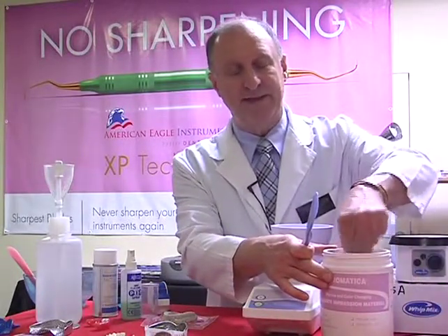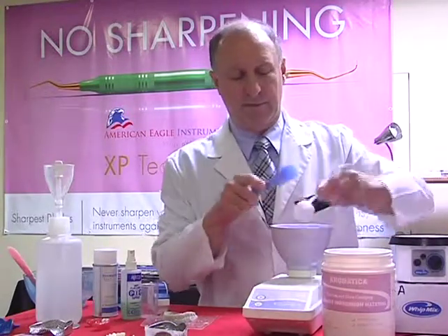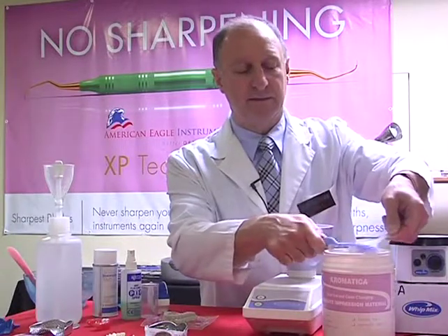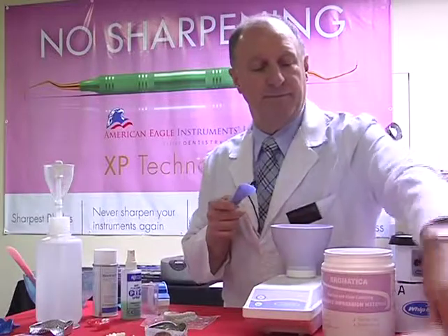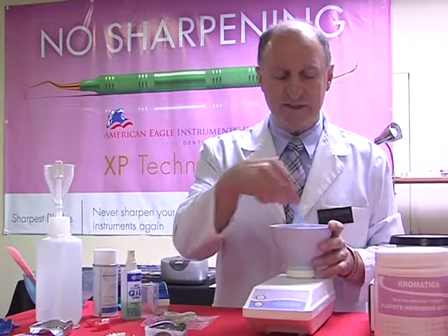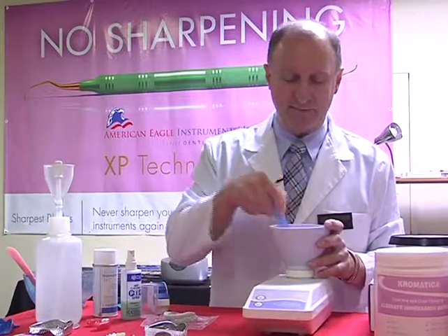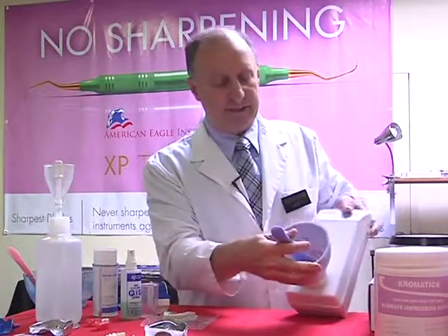So packing our scoop tightly, sliding off, and then the same thing, doubling that up twice. Now the first thing I do is lightly wet the material that's inside the bowl. Once everything is moist, I'm going to turn this towards you so you can see, because right now you're probably wondering what's happening inside the bowl. So let's revolve that around a little bit.